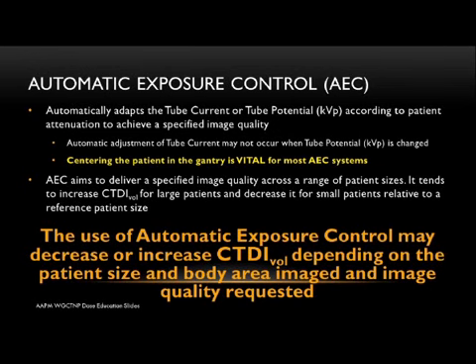It's not always easy to check, because you've got to go through and look at all the different scouts and see, AP versus lateral. But there are maybe some ways that the technologist can identify after the fact, oh, you know what, we didn't center this patient that well. Flag it for review, that kind of stuff. So maybe something to take home and consider. And for those institutions that are already doing it, excellent, kudos.